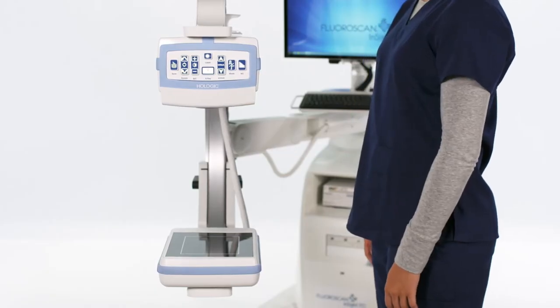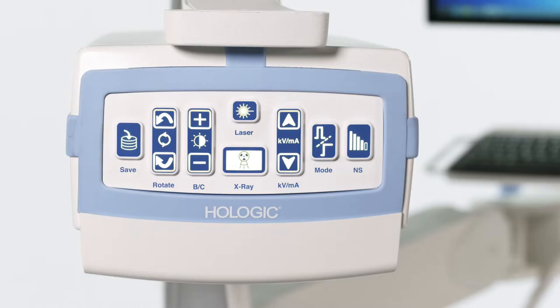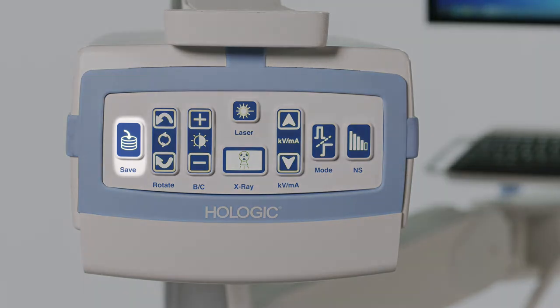The X-ray source is located on the C-Arm and houses the sterile field controls. These sterile field controls have the option to save, rotate, adjust brightness and contrast, take an X-ray, adjust KV and/or MA, change acquisition mode, cycle through noise suppressions, and turn on the laser.